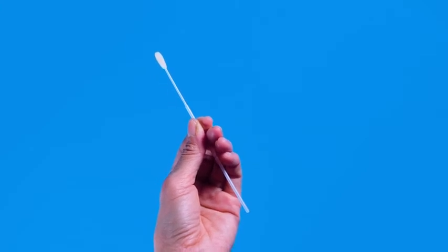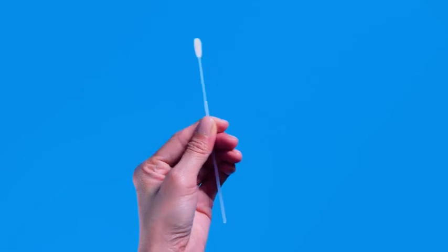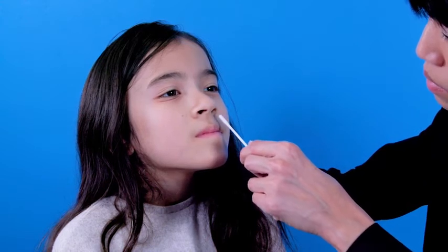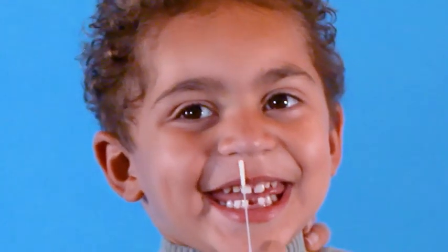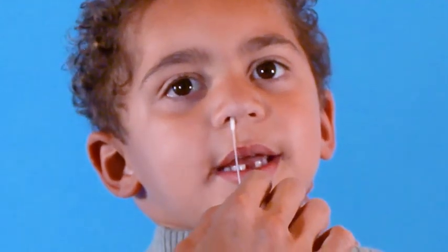Hold the swab at the midpoint. Please ignore lines or markings that may be on your swab, as they are not related to this test. Hold the child so that their head is still. Slowly and gently insert the swab until the swab head is no longer visible and you meet resistance. As a reminder, for children 2 to 5 years old, it is not necessary to insert the full swab head. If you are unable to insert at least half the length of the swab tip, the sample collection may be inadequate and potentially affect test performance.